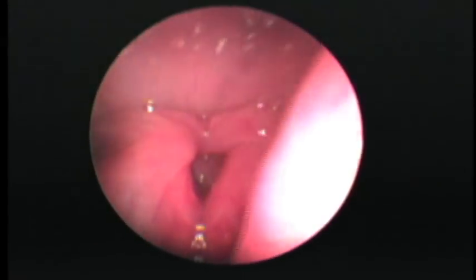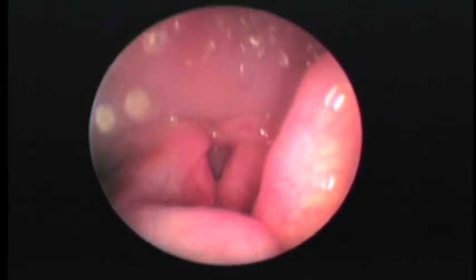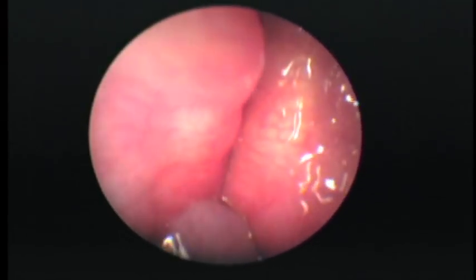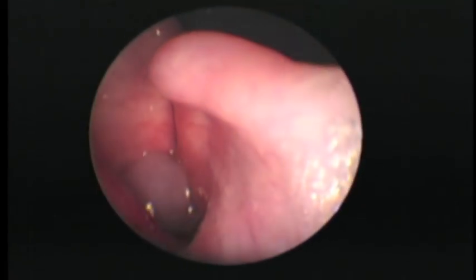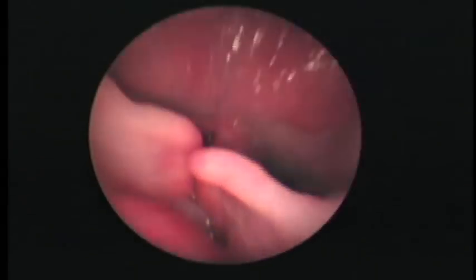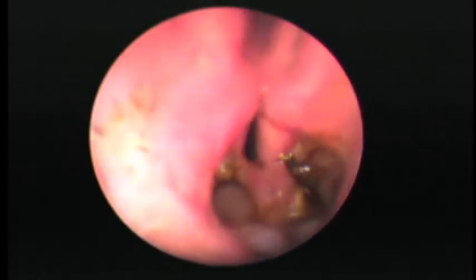So then we move back out. In this case, I don't think the laser was through my scope, but I have an extension that I can put the laser through the scope. We're going to take the laser at a very high level at a constant laze. We have a Luxar that has a super pulse laser, but we don't use the super pulse — we just use it at constant.